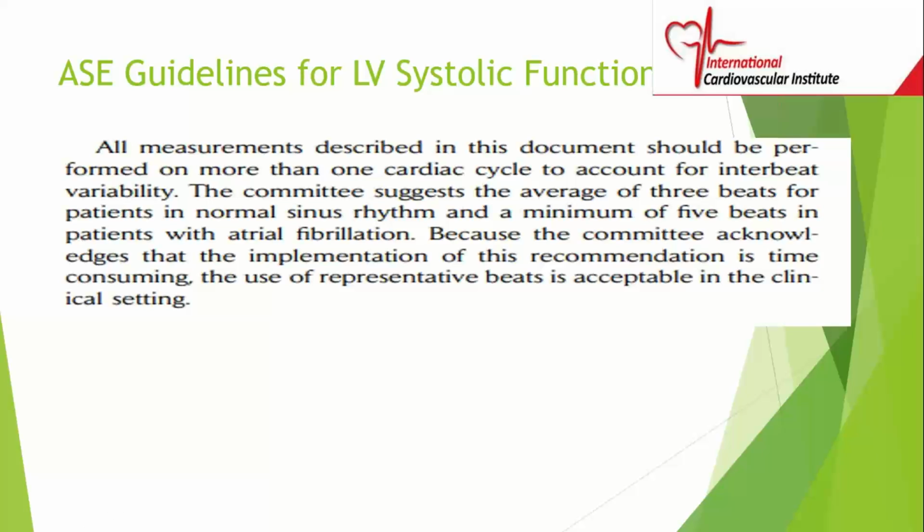Say the patient has mitral stenosis and you're looking at the mitral inflow and you want to do pressure half-time. If the patient is in atrial fibrillation, you need to do a minimum of 5 beats and average them. If the patient is in sinus rhythm, you can do 3.